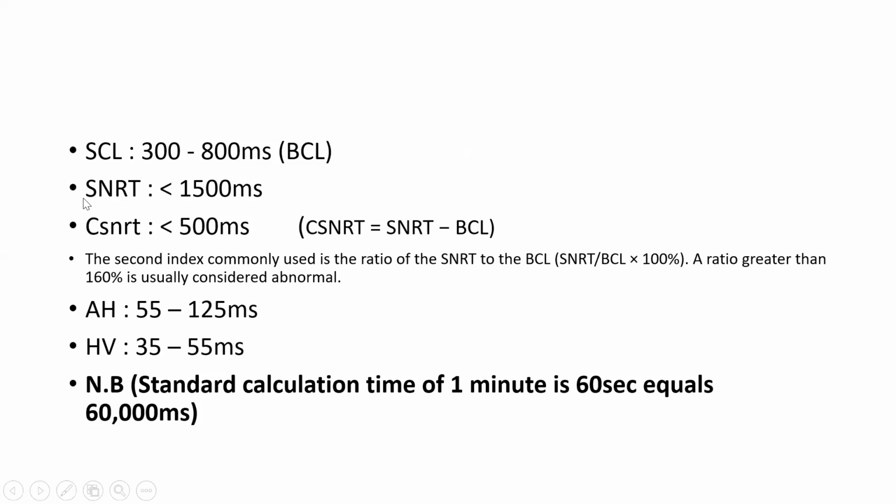So there's what is called sinus node recovery time. What does sinus node recovery time mean? Sinus node recovery time helps you to know the ability of the SA node to recover after suppression. So we can suppress SA nodal activity by doing what? Pacing the atrium to suppress the intrinsic SA node.